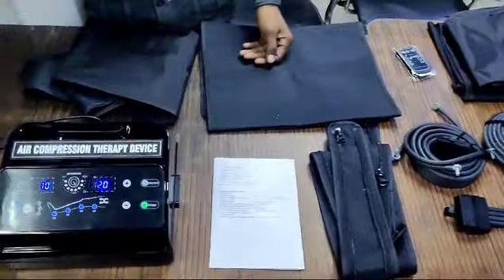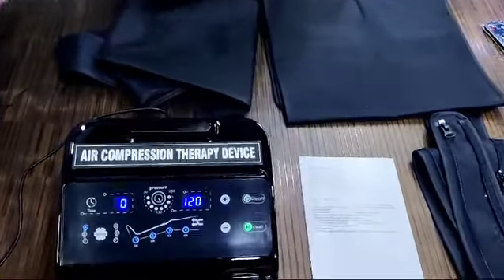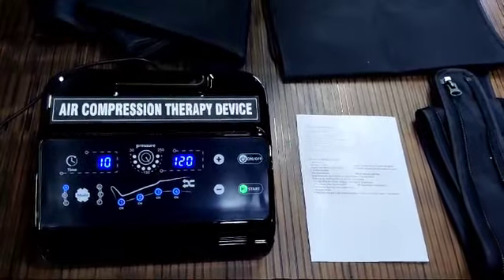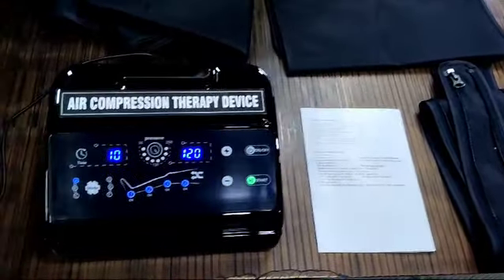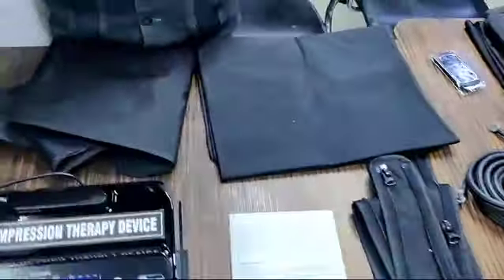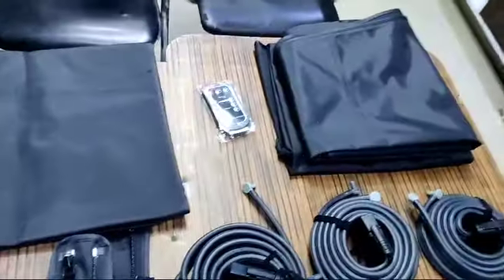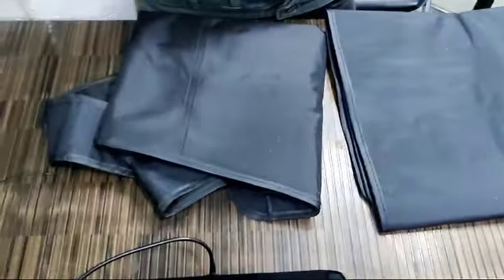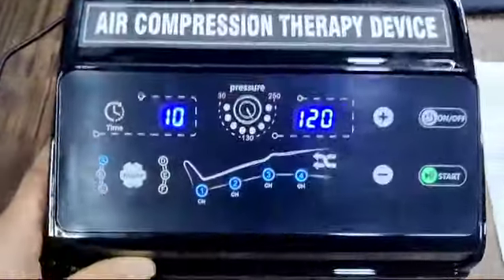This is the Biotronics air compression therapy device, digital model, four-chamber with remote control. Attachments include two leg attachments, one waist attachment, one arm attachment, and connecting tubes. This is how the device looks.